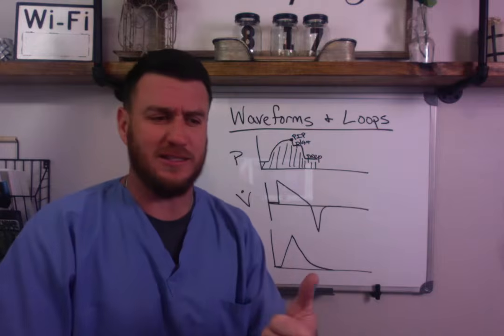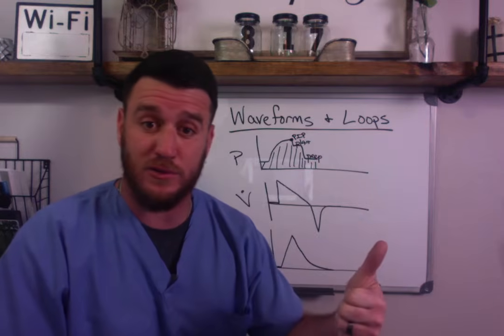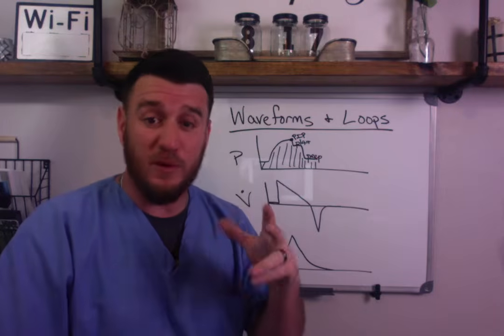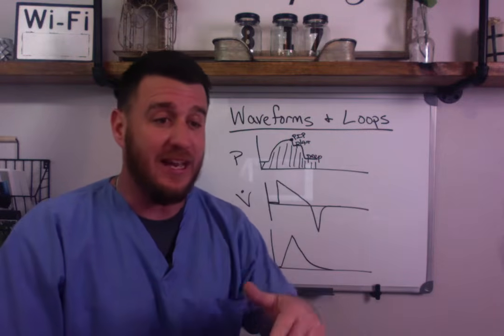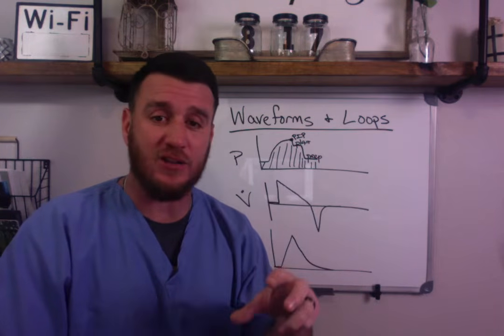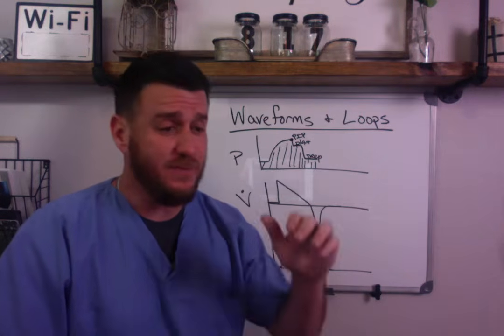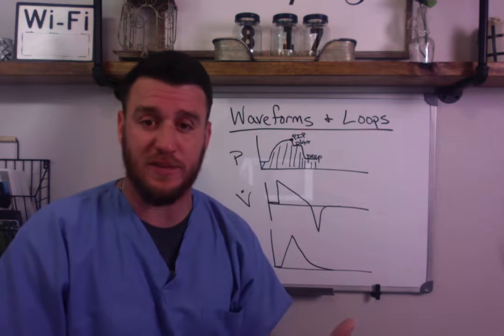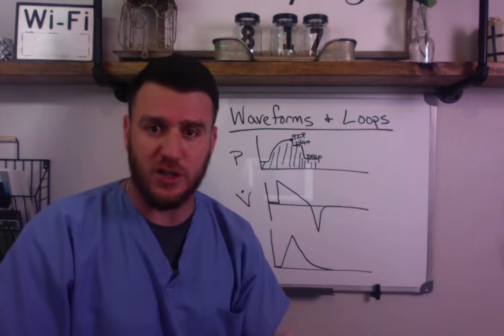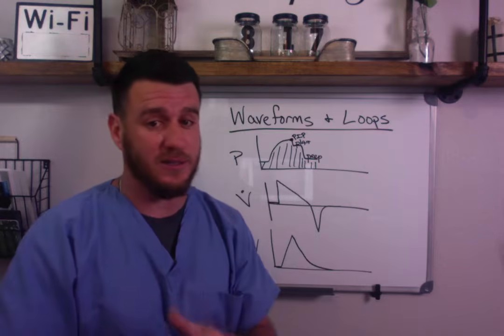And everybody understands that the two ways we can increase PaO2 is by increasing FiO2 or increasing PEEP. But what we fail to understand sometimes is that when we increase PEEP, what's really happening is that we're increasing mean airway pressure. And mean airway pressure is what actually works to recruit atelectatic alveoli, increase FRC, and improve oxygenation. It actually gains more functional alveoli. That's what FRC is, functional residual capacity. And so when you understand those concepts, you're in a good place to understand where you are.